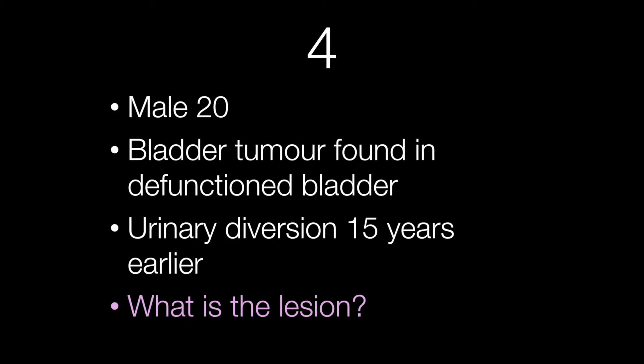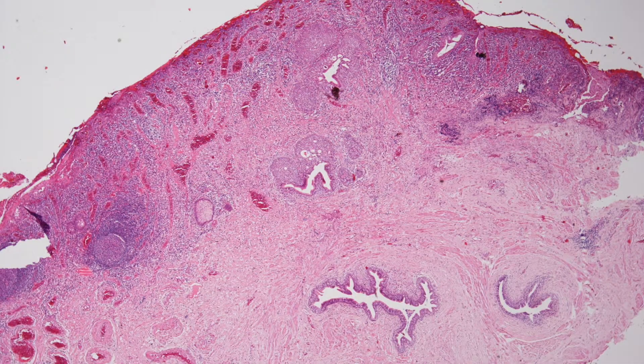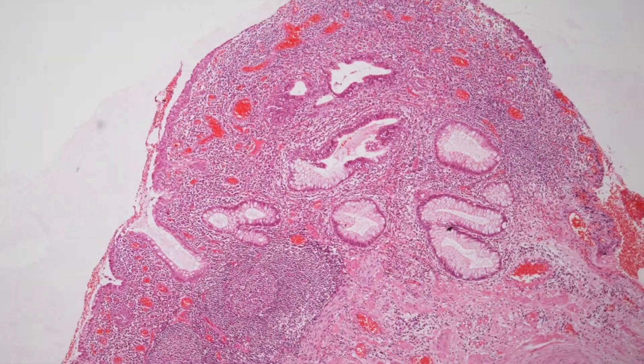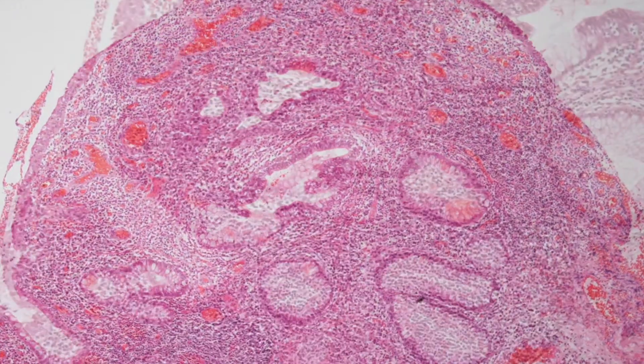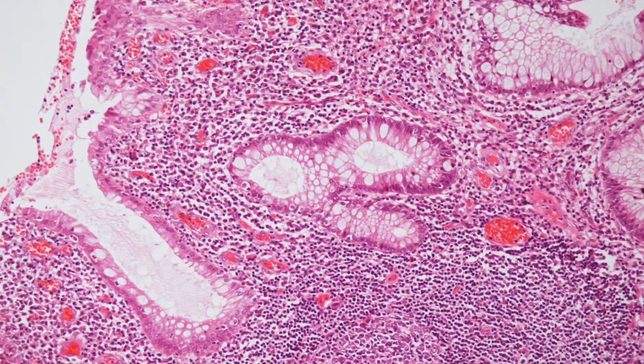Case number four is from a male of 20. He had a bladder tumour found in the defunctioned bladder and had had a urinary diversion 15 years earlier. What is the lesion? Here is a low power overview of the piece of bladder. Here are some higher power views.